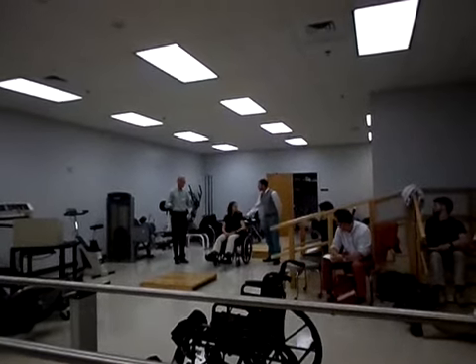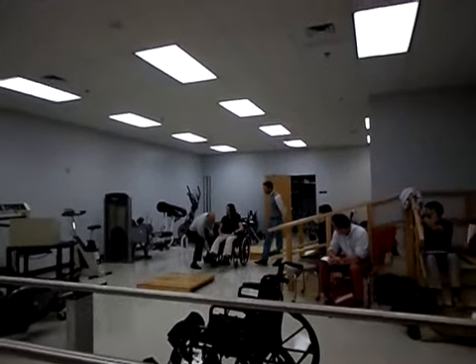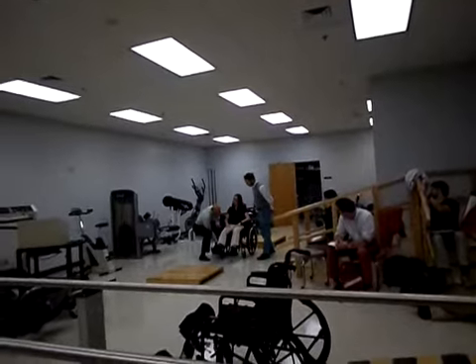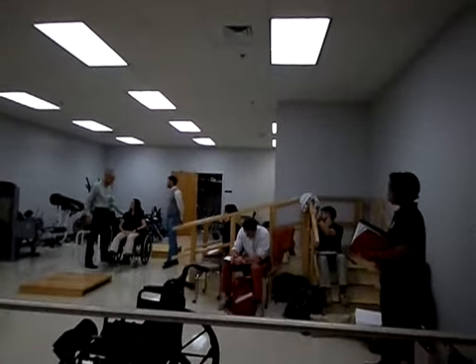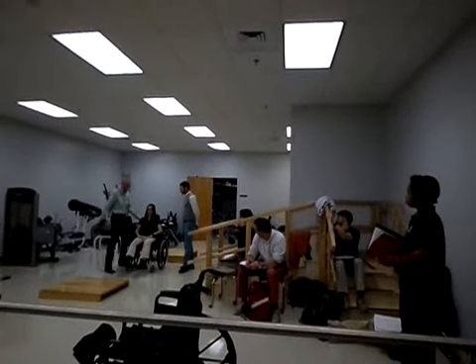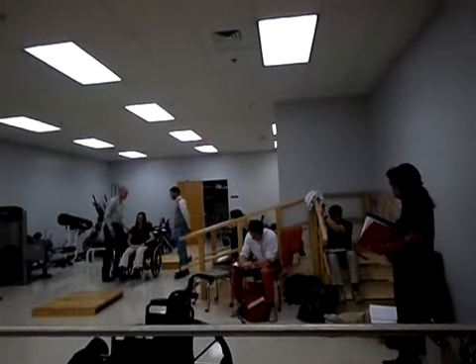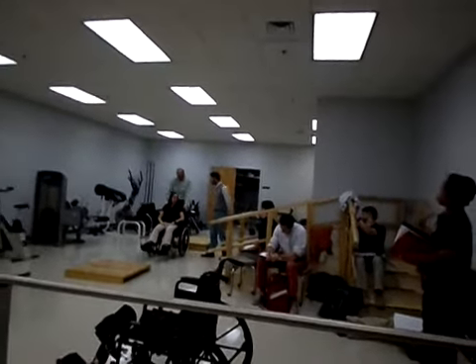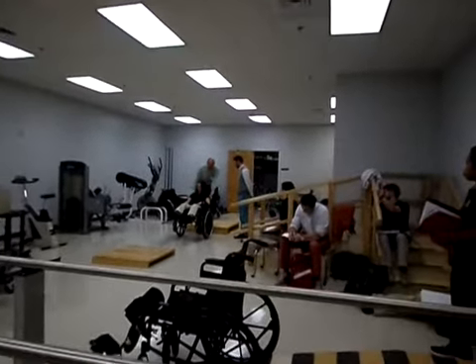Well, you get the other handles. You can grab one of the other handles if you can. There's also bars down low that you can grab. And actually, a good way to do it is to have one hand on the handles and then one hand on one of the bars that's solid down here to help. Okay. Take you backwards. Right next to the curve.